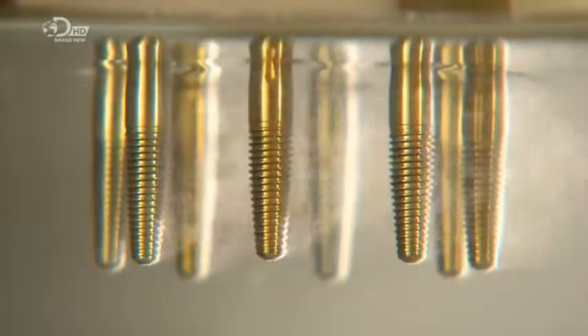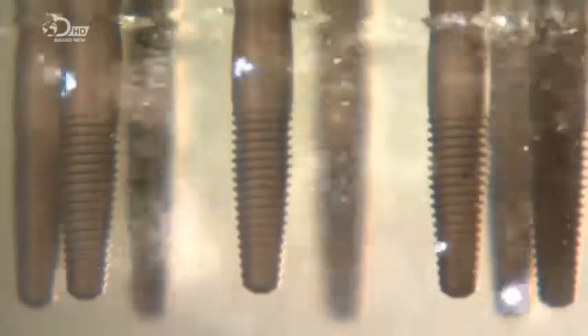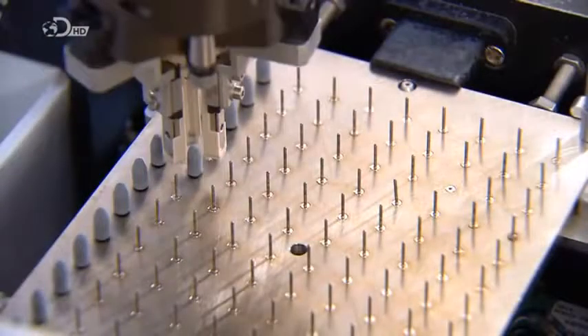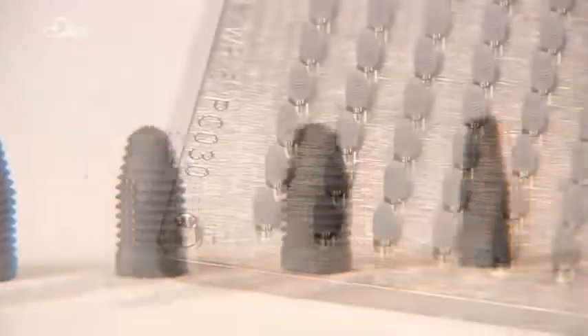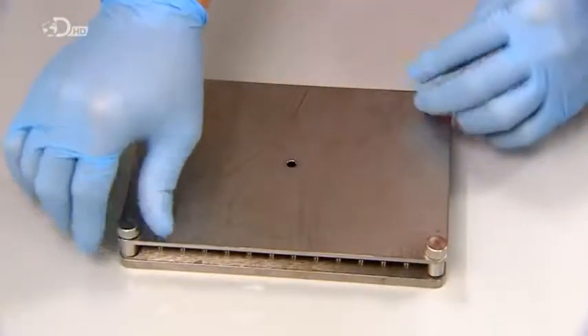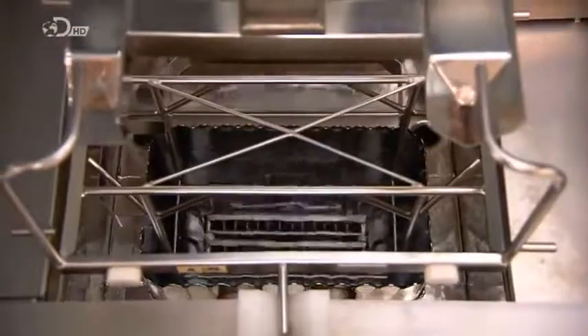The implant sparkles in a solution as it undergoes a transformation. Here's the new porous surface magnified by a microscope. A robot transfers the dental implants to another tray — they're now ready for a final cleaning. They go into a tank full of hot, purified water. A generator sends high-frequency sound waves into the water, creating bubbles and waves that gently scrub the implants.